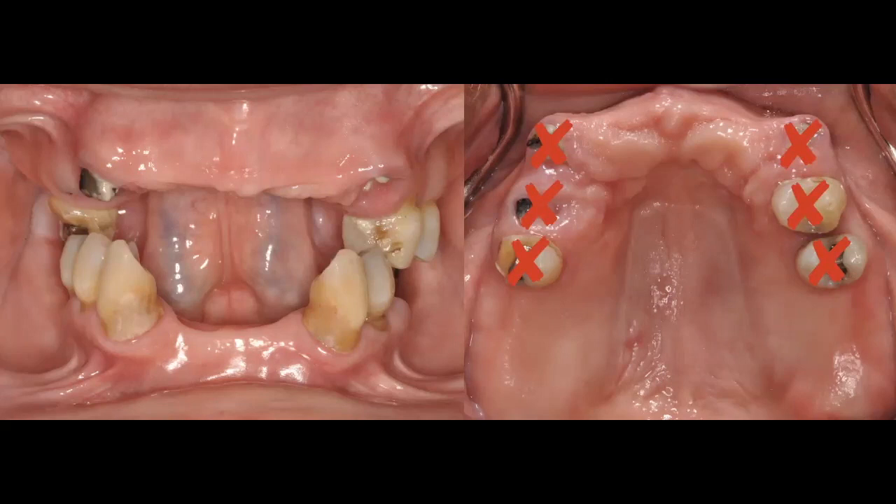When you have cases like this, the ideal approach is to take the best alginate impression you can of the remaining teeth and surrounding tissues — overextended, copying all frena and muscle attachments. Sometimes I even fabricate a custom tray for these patients to get my final impression for the interim denture, because that interim denture plays a big and important role: the patient leaves with teeth, and the tissues heal well for final impressions three to six months later.